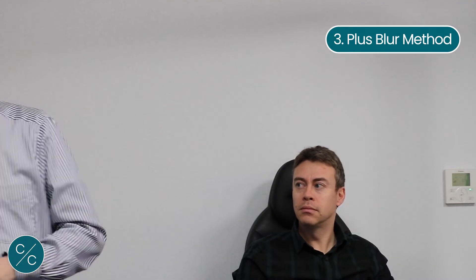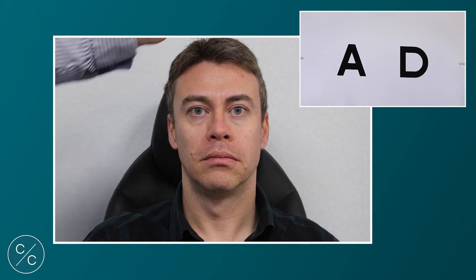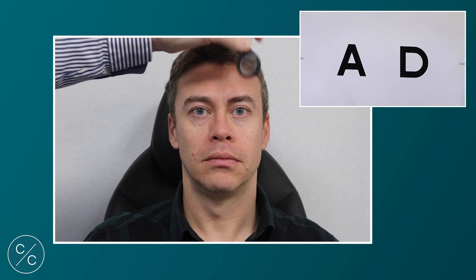One further test that I'd prefer to do is using a plus 1.50. Now this will seem a little bit strange, but I want you to tell me which is the least uncomfortable. Look straight up at the large letters, keep both eyes open. Does it feel better with the lens in position one or in position two? One. Two. This is showing that he prefers not to have the dominant eye blurred. So again, it confirms that Maurizio is right eye dominant.